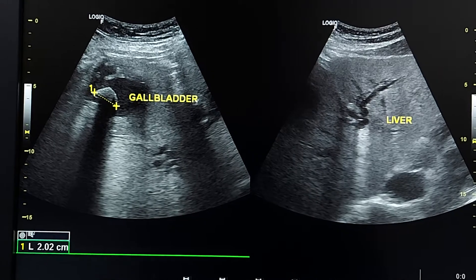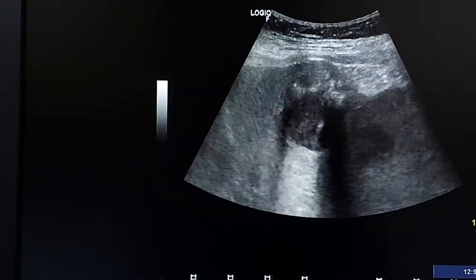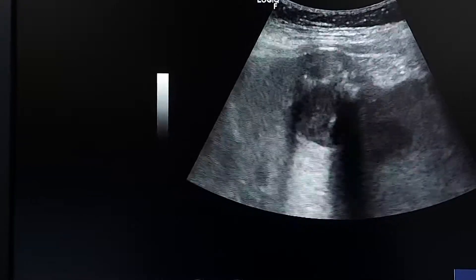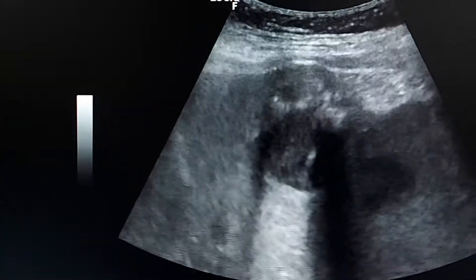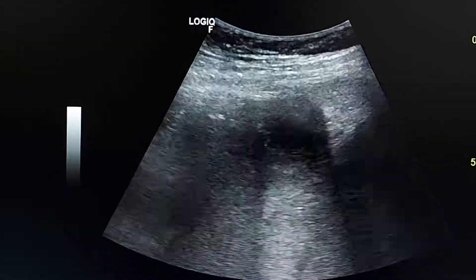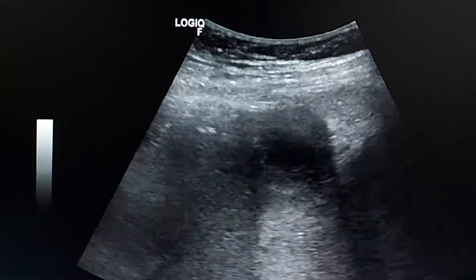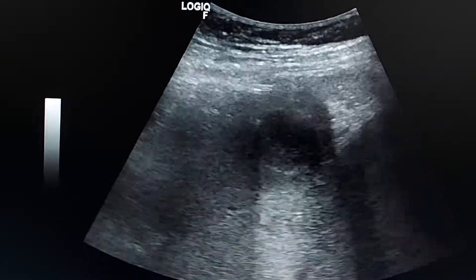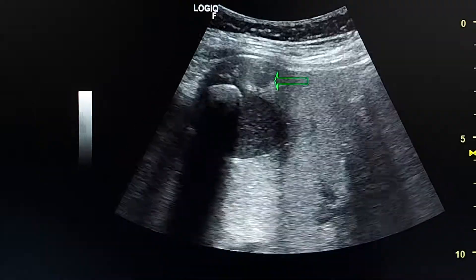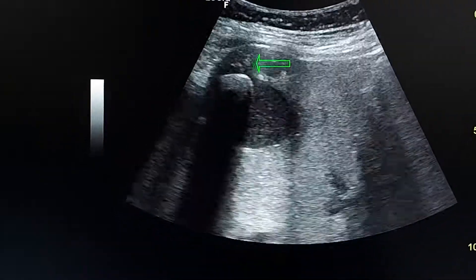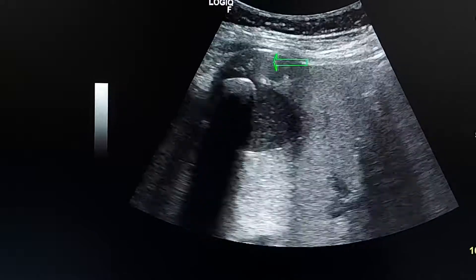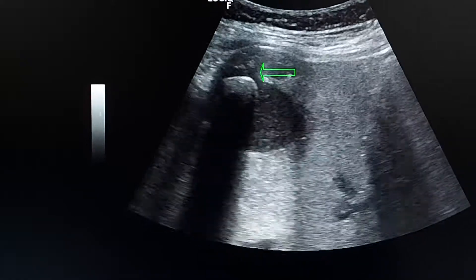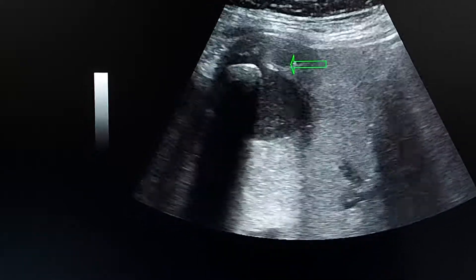Gallbladder wall cancer infiltrating the lower edge of the liver, with gallbladder stones. Here we can discriminate between the bladder wall and the adjacent hepatic parenchyma. This is the thickened, focally thickened wall of the gallbladder, which is infiltrating the liver.